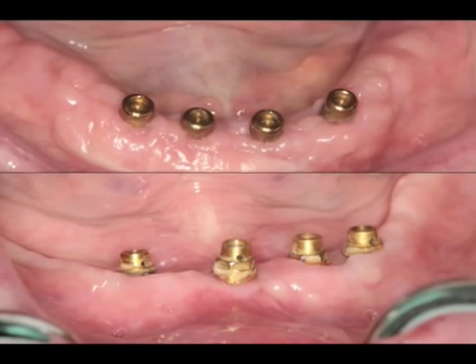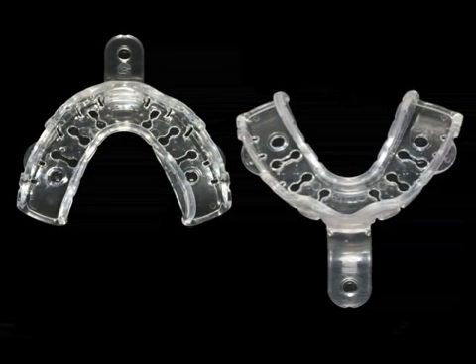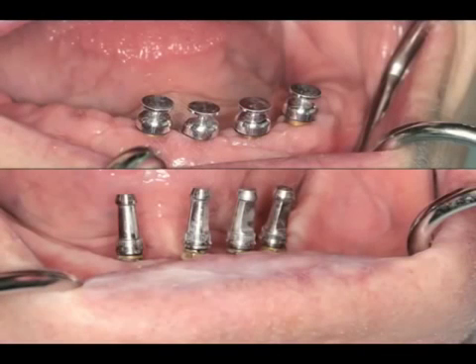In this slide, what I'm showing are 2 different implant systems. We have one implant system on the top part of the slide and another implant system on the bottom portion of the slide. Each of these implant systems have different implant impression copings. Some are short, some are long. We're going to take the tray and we want to heat shape it to make sure it properly fits the arch. We can heat shape any part as previously discussed with the DENPLANT trays.